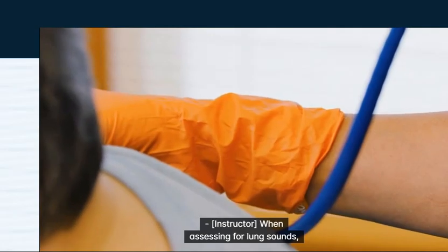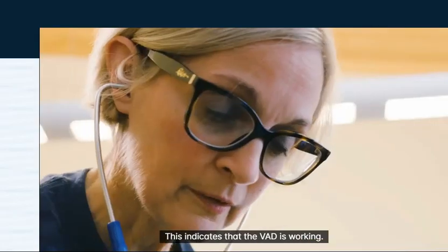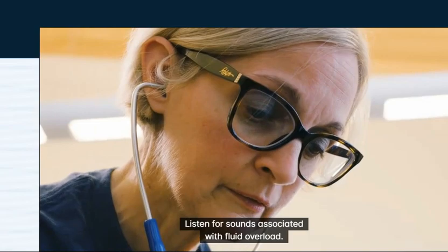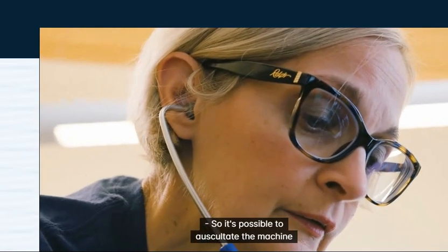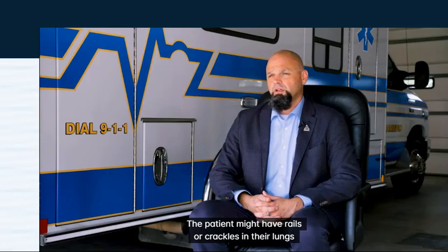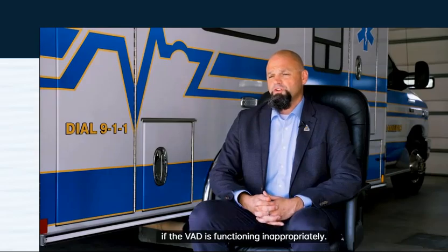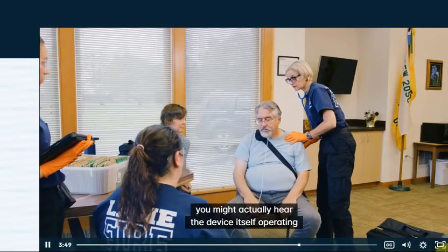When assessing for lung sounds, you may hear a whirring or humming. This indicates that the VAD is working. Listen for sounds associated with fluid overload. So it is possible to auscultate the machine while you're assessing the patient's lung sounds. The patient might have rales or crackles in their lungs if the VAD is functioning inappropriately. But in a patient who's breathing normally, you might actually hear the device itself operating in the background.